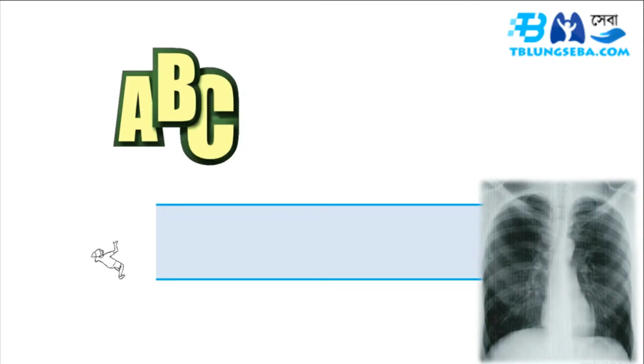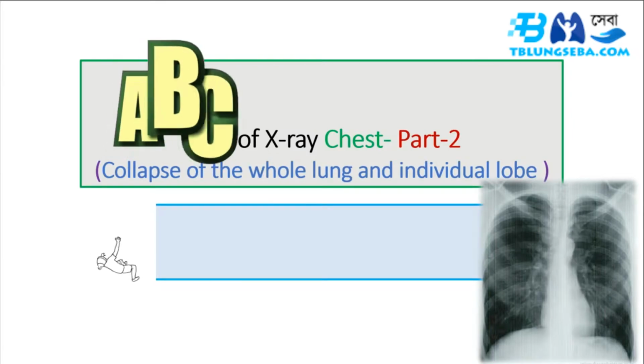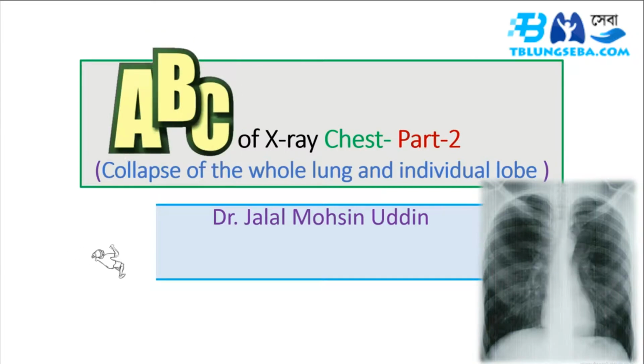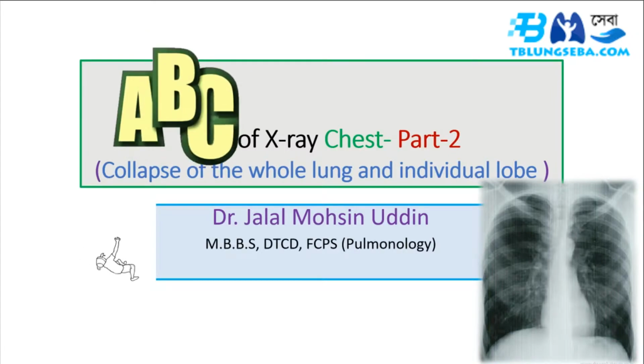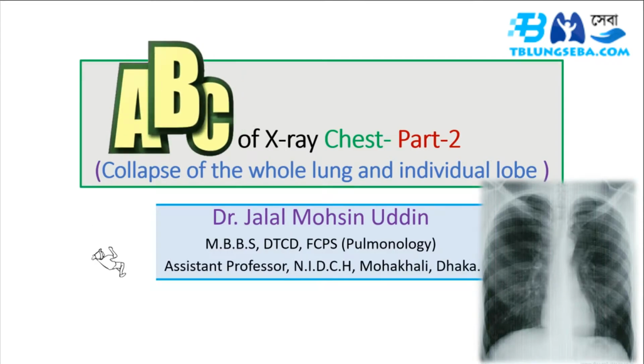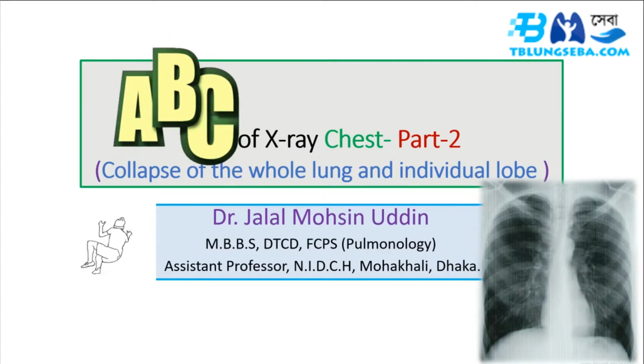ABC of X-ray chest Part 2: collapse of the whole lung and individual lobe. Dr. Jalal Mohsin Uddin, M.B.B.S, DTCD, FCPS, Pulmonology, Assistant Professor, N.I.D.C.H, Mohakhali, Dhaka.